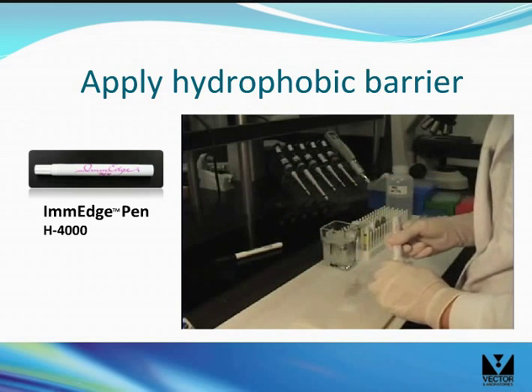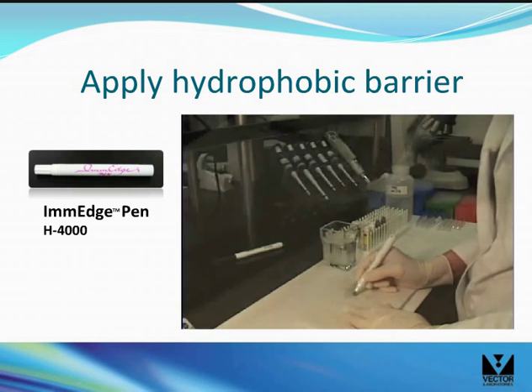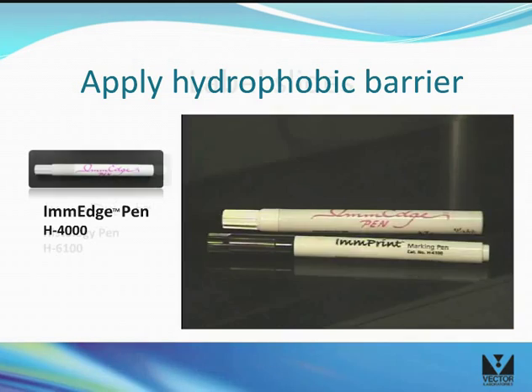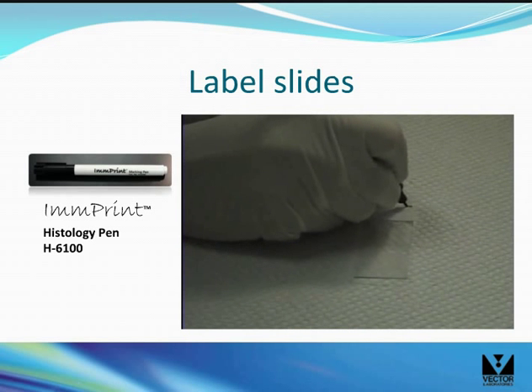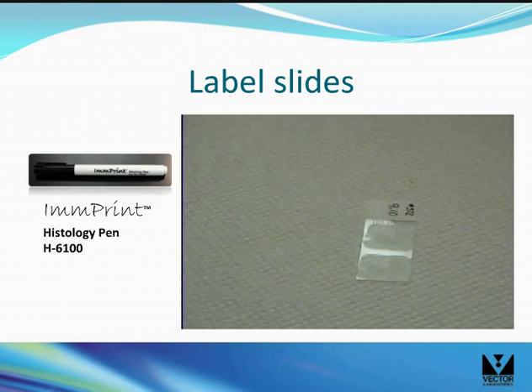Use the pen to draw a line between tissue sections on a slide or to draw circles around each section on the slide. Use the imprint pen to label the slides. The imprint pen is resistant to most organic solvents like alcohols and clearing agents that are commonly used in staining protocols.